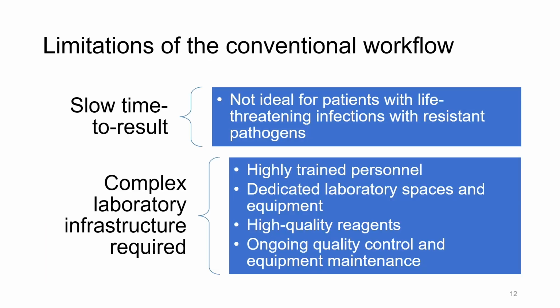So the main limitations really are the slowness of the workflow and also the fact that it requires this complex infrastructure. So the lab requires really highly trained personnel as well as proper quality control, proper reagents, all this that's very challenging to implement even in Canada, let alone in limited resource settings.